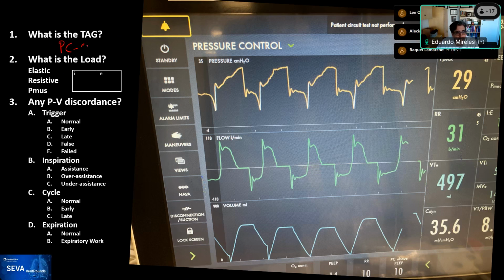So this is definitely PC-CMV, and the salient feature here is obviously, we've talked to death, that pressure control is not perfect in ventilators. But you would look at the flow, and each flow is different. So this is definitely pressure control. And then CMV, you see the pause, and that is telling you that this is an I time. It's a time-cycled event, so all of them are mandatory. And in this case, it's set point because we set the amount of pressure. You can see that the pressure was set at 10 above PEEP.